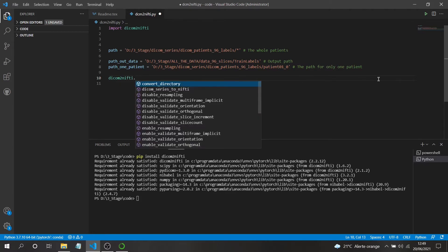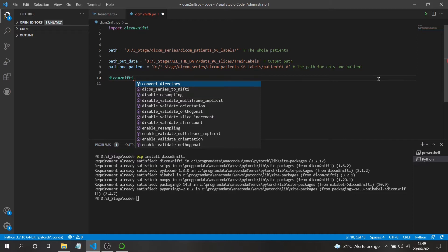There are two functions available in dicom2nifti to do this: convert_directory and dicom_series_to_nifti. Both do the same thing, but with convert_directory you don't have access to name the output file — you just give it the input directory of DICOMs and the output path, and it will name the file automatically, something like '1.nii'.